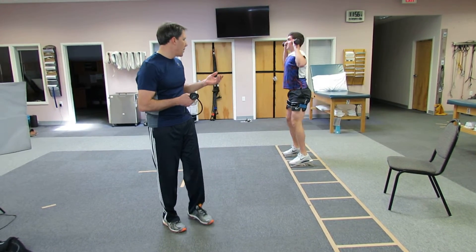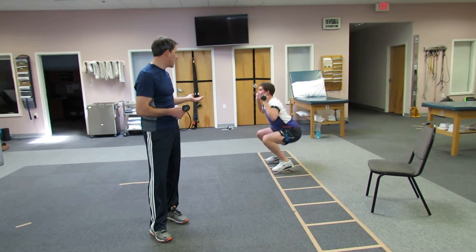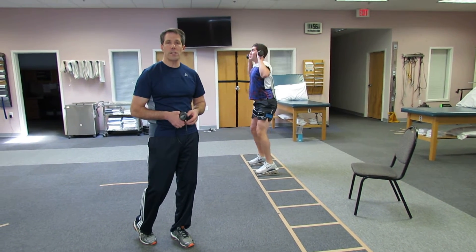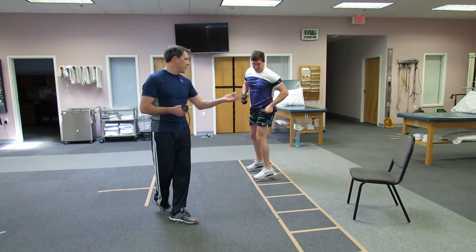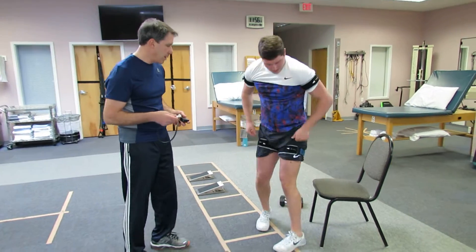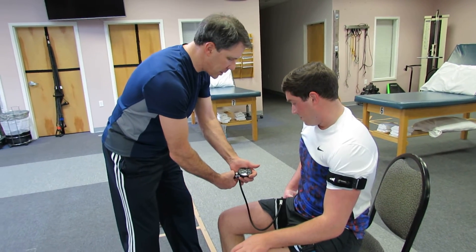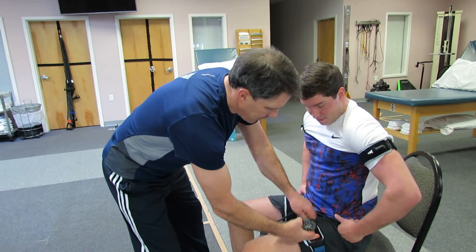As you can see here, Michael is doing a combination of exercises, both upper and lower extremity. After he's done his third set of 30 repetitions, it's always good to recheck the pressure in the cuffs. So Michael, I'll have you come sit over here. We'll assume that is his third set of 30 reps. We'll check his pressure and make sure it's still up to snuff. Sometimes you lose a little pressure — you just readjust. It's simple enough to do.